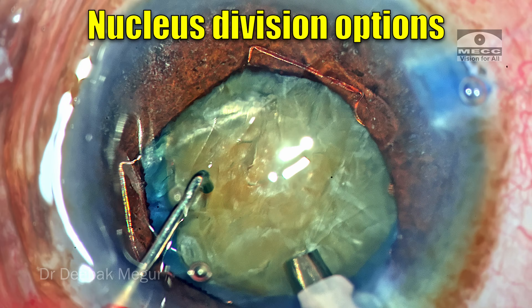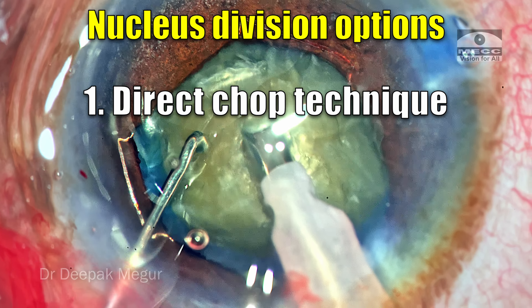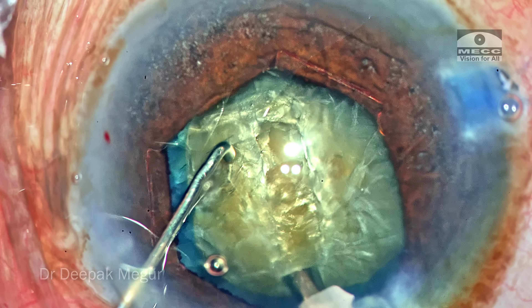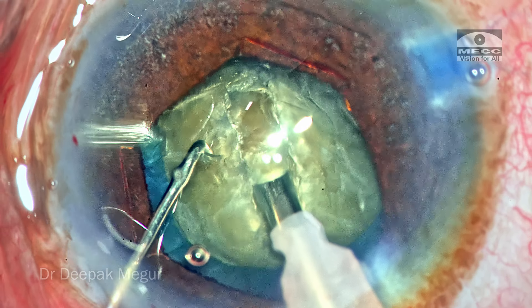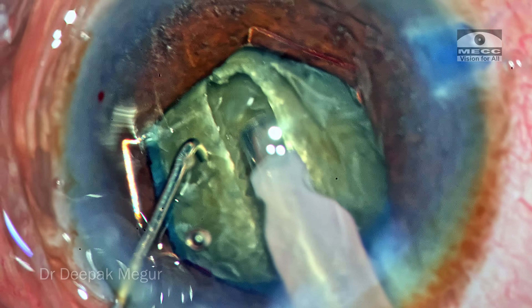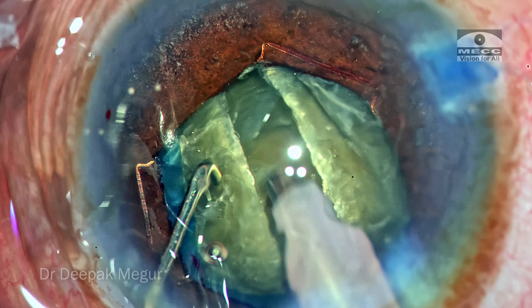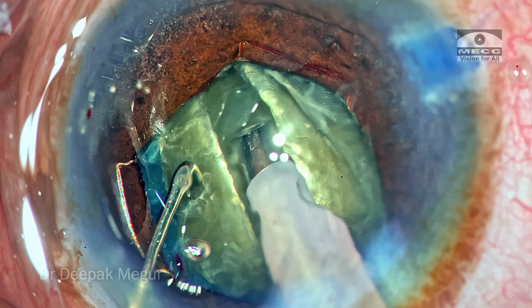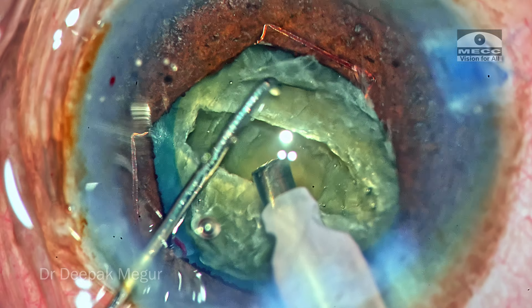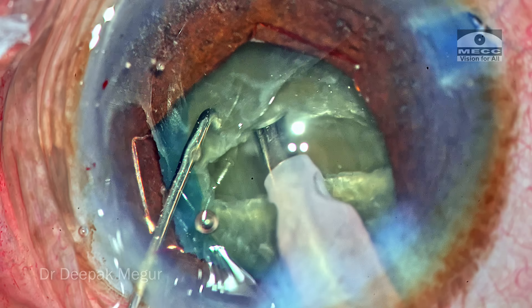My strategy to divide the nucleus: among the options of direct chop, stop and chop, or divide and conquer, I have consciously chosen divide and conquer to ensure that chopping and lateral separation maneuvers are less stressful to the bag. If you can achieve a deep sculpt that breaks the backbone of the cataract, dividing the nucleus into smaller fragments is much easier than trying to directly divide a dense cataract in eyes with a wobbly bag.